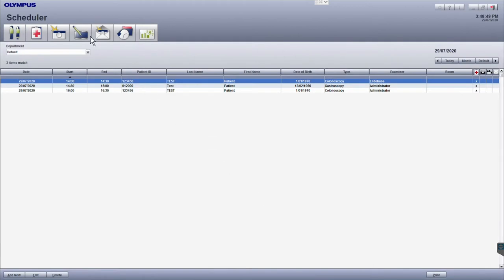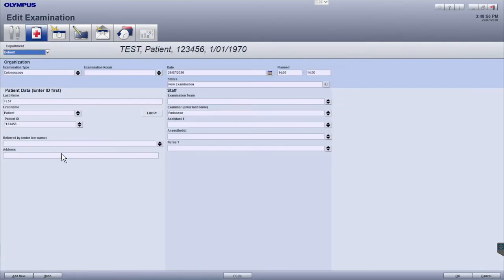The next icon, indicated with the red plus, is the examination data module, which allows you to schedule and edit examinations for a particular patient.